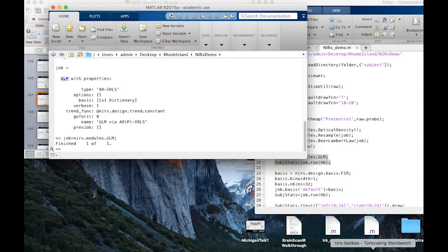We're also doing what's called weighted least squares, which deals with the second problem in the NIRS data, that we often have motion artifacts. This data I don't think had that many motion artifacts, but if you deal with kids, I guarantee your data does. And those artifacts, right, we saw the data cruising along and then suddenly jumps up and then comes back down and maybe shifted and so on. But those time points where it jumped up and came back down were so much higher noise than the rest of the data, right?